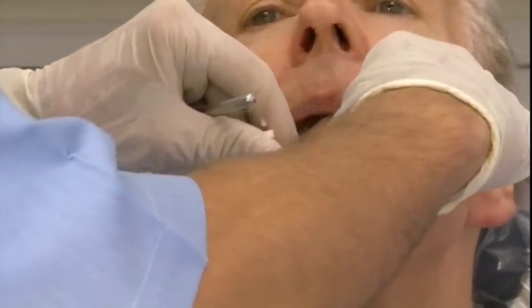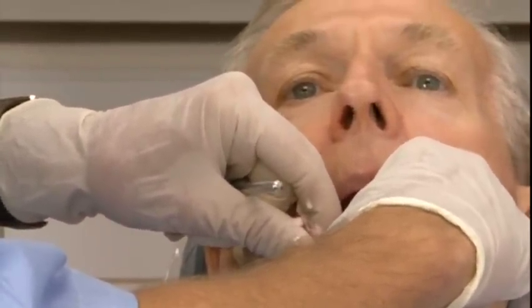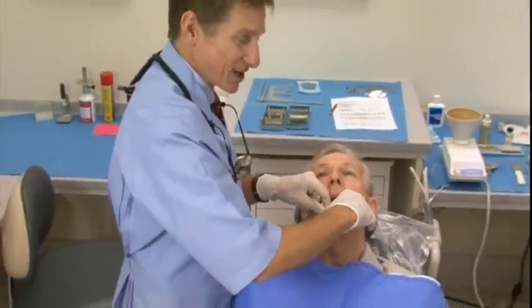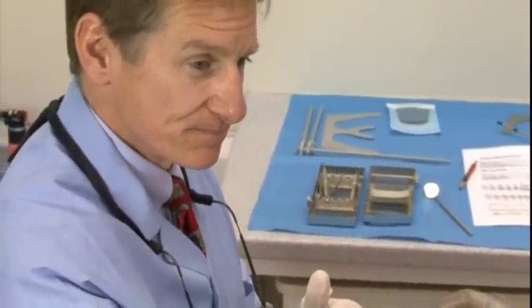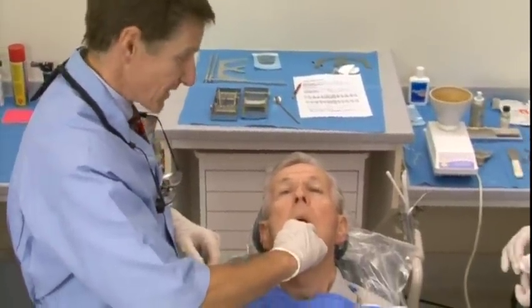Stick your tongue out one more time and relax. Notice my hand position — I'm relaxed, my elbows are down, my shoulders are relaxed, and I can transmit that relaxed feel right into the patient. This is a very anxiety-provoking procedure. When participants ask how you know when alginate is set, most say they'll stick a thumbnail in it — but that tells the patient you don't really know. When you set a timer and say it's got one more minute, you're telling that patient we know our stuff and our materials. That's called added value.